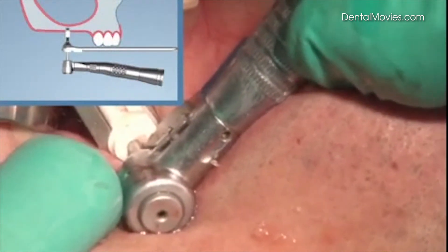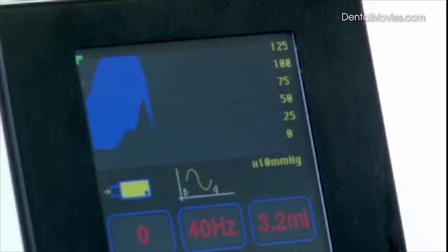As soon as there is enough pressure, the drilling starts and is continued until the pressure drop on the display indicates the successful perforation of the bone.